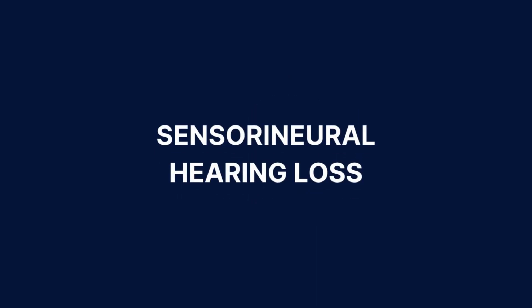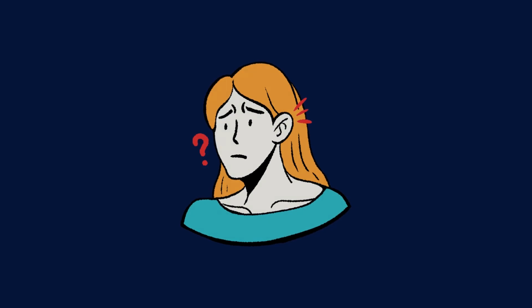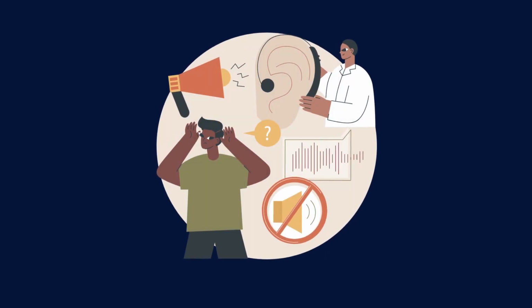On the other hand, sensorineural hearing loss is where the sound does not lateralize to the affected ear, but instead the sound is louder in the unaffected ear. What the Weber test does is determine which part of the ear is related to the hearing loss. If the hearing loss is unilateral conductive, the affected parts of the ear are the outer and middle ears. If the hearing loss is sensorineural, then the affected part is the inner ear. This test should only be conducted by audiologists and ear, nose and throat doctors.